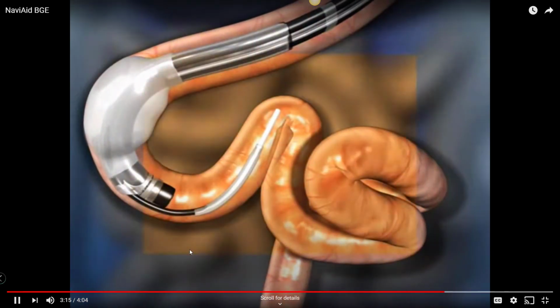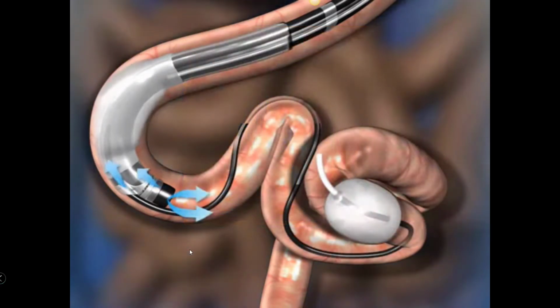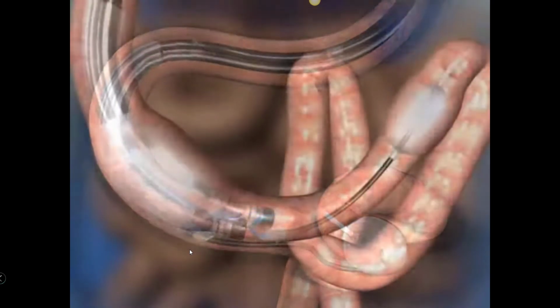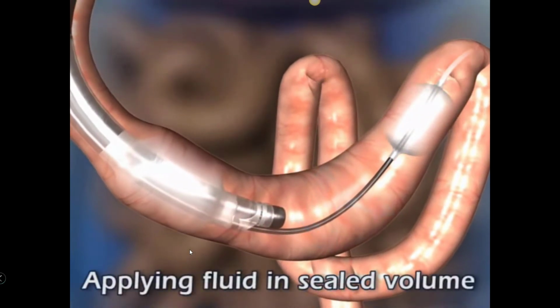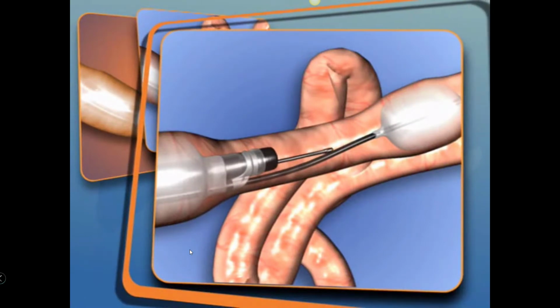Fast and efficient advancement is facilitated by a highly flexible advancing tube and by efficient intestinal insufflation. Simultaneous balloon inflation allows fluid application through the endoscope tool channel into the sealed intestinal volume. Air insufflation may provide better visualization of the lumen.